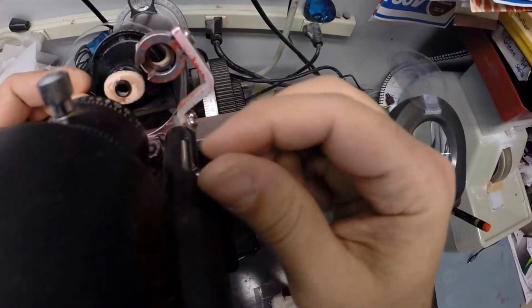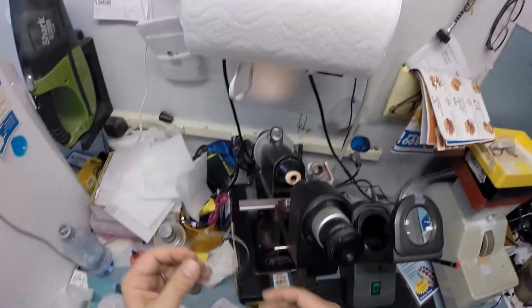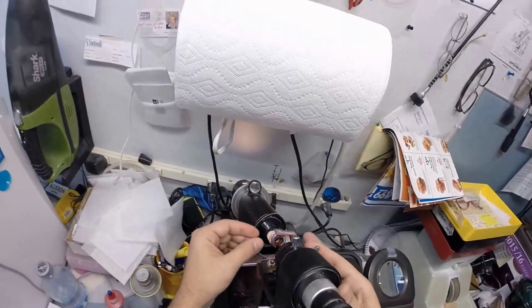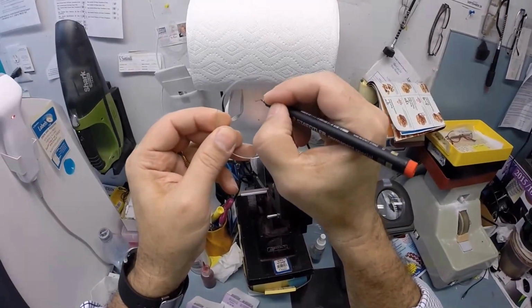So again, find the optical center. I do not have to rotate the lens because this is a spherical lens. Now we have it. And I'm going to do the same thing now for the other lens, the left lens. Put that in. Find the optical center, put a dot on that lens as well, and I'm going to mark this one right, and I'm going to mark this one left.